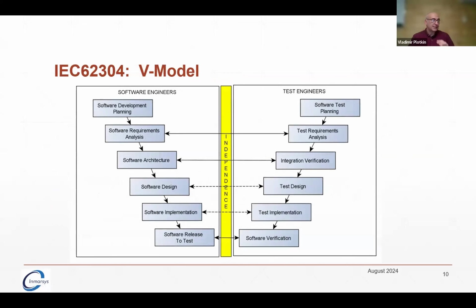Now, one of the questions, again, frequently asked, is the standard itself seems to be like a waterfall. Can we use Agile? Yes, you can. It's a good practice to have a big set of requirements at the very beginning, and then you can split them into small sprints, implementing those requirements, let's say 2-week sprints, and then you go into another sprint, thus implementing the whole thing.